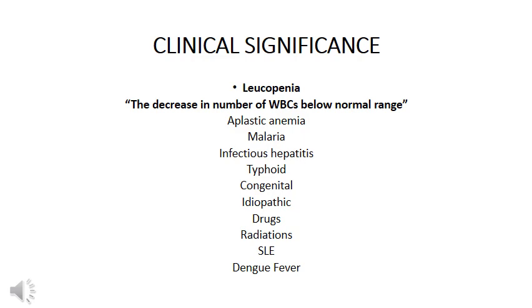I'm going to summarize this topic. Nowadays we have many automated analyzers available in our hematology laboratory, but sometimes we have to verify the automated results with manual counting, to check the efficiency of the machine or automation. So how can we manually count the WBCs? We can count them by this method. Simply, we have to dilute the sample in Turk solution, as much as we mentioned. After diluting, we load it on the Neubauer chamber and count the WBCs through the microscope. The WBCs will easily be visible.